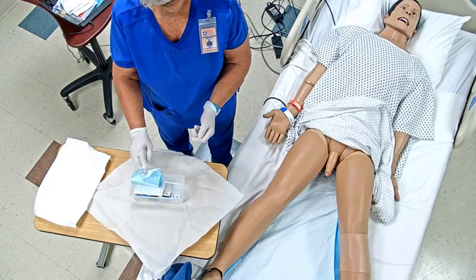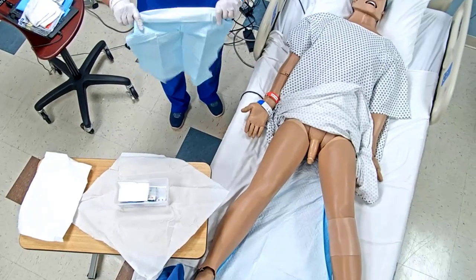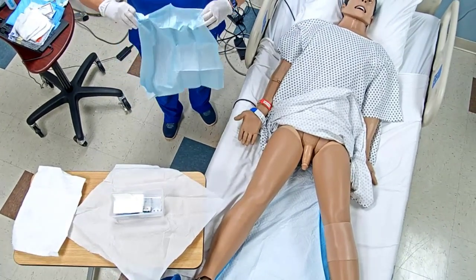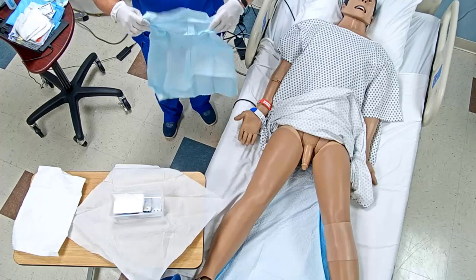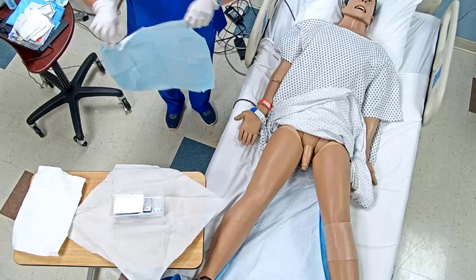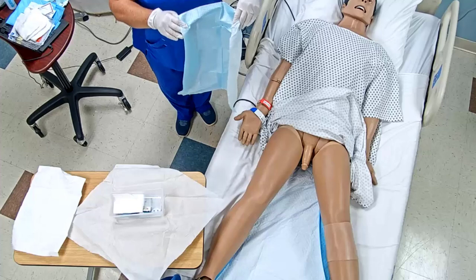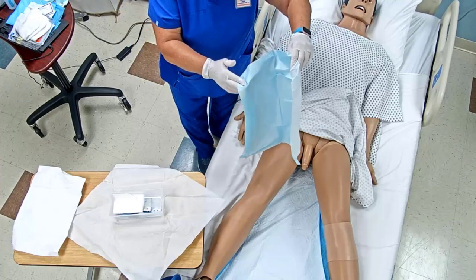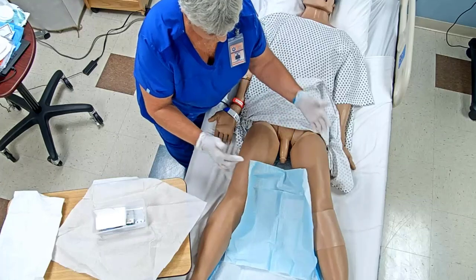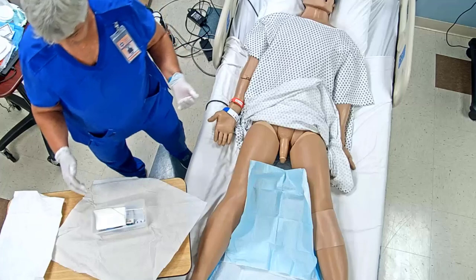So this part over here, pull that up. Okay. The impervious side, so the blue side goes up. Okay. I'm sterile to sterile here. I'm just kind of getting it where it won't fold up on me. Okay. And I want to make sure this whole time that I'm not crossing over my field, but that I'm keeping my sterile field in my sterile side. Now that's fine. I can adapt that here in just a little bit.